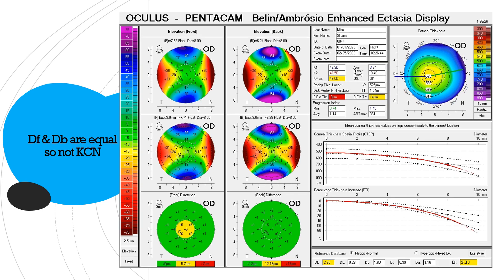Here is another example where only DF — the front elevation — is suspicious. All others are normal and total D is slightly abnormal. The Belin lines are not leaving the dotted lines, and not leaving the dotted line in the PTI either. K max is slightly high and back elevation is slightly in the suspicious range. So this is a suspicious case, but not frankly a full-fledged keratoconus.